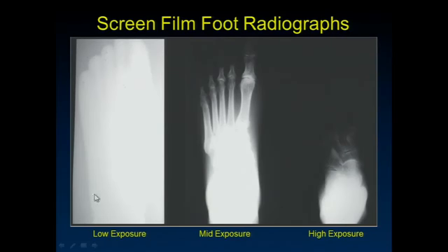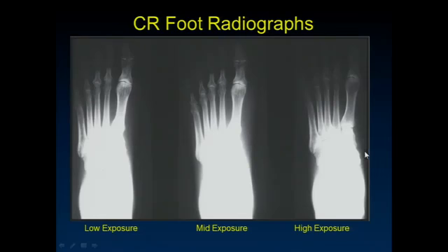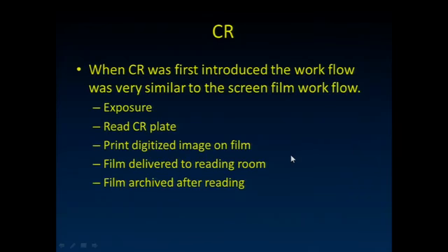So here's screen film foot radiographs, right? Low exposure, mid exposure, high exposure. And one of the big benefits of CR is, like we said, that more uniform response, really, that linear response across a wide range of exposures.